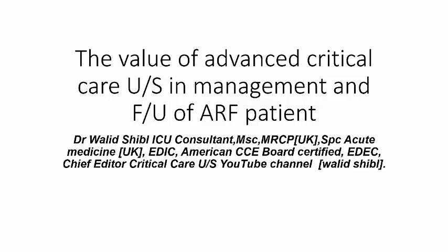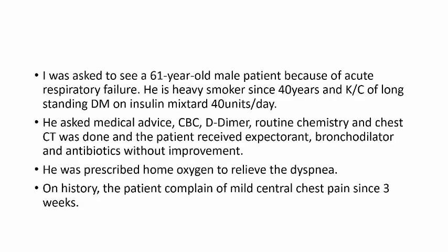Good morning, everyone. I'm so happy to meet you again in this new project, the value of advanced critical care ultrasound in management and follow-up of acute respiratory failure. I was asked to see this 61-year-old male patient because of acute respiratory failure.